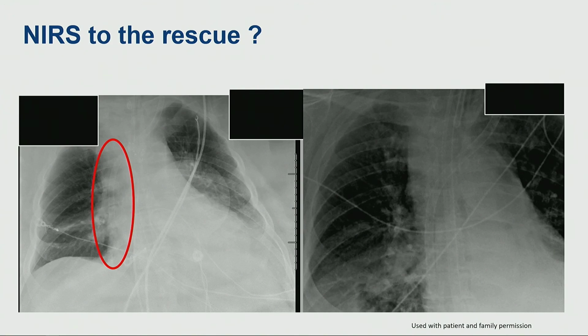When these catastrophic events happen, they happen really quickly, right? This comes out, there's a cardiac arrest in like 30 seconds, right? There's like 4 liters per minute of blood flow going into the neck instead of going inside, right? Where we use the NIRS here is that we had a significant hematoma in the neck, even after repositioning the cannulas, right? We were worried about carotid compromise. So we got the NIRS back on this patient, and then we monitored left and right-sided NIRS just to make sure that there was not an impending, expanding hematoma and right-sided carotid compromise. That's how we used the NIRS.